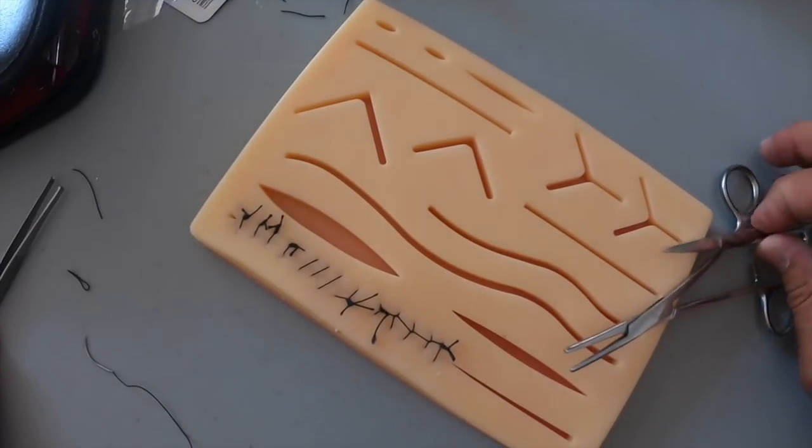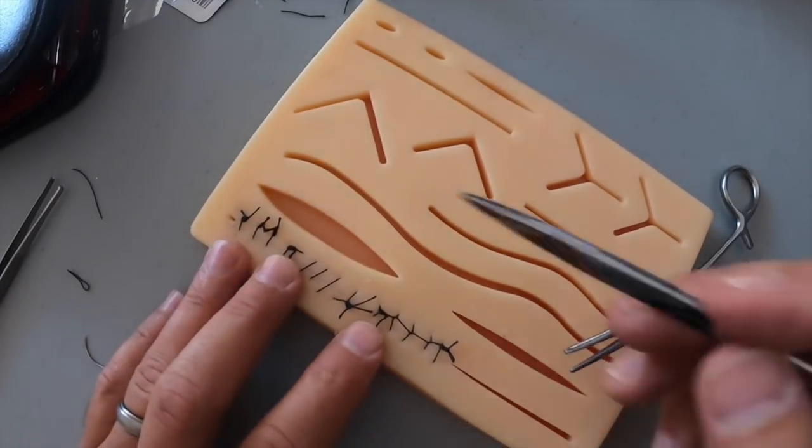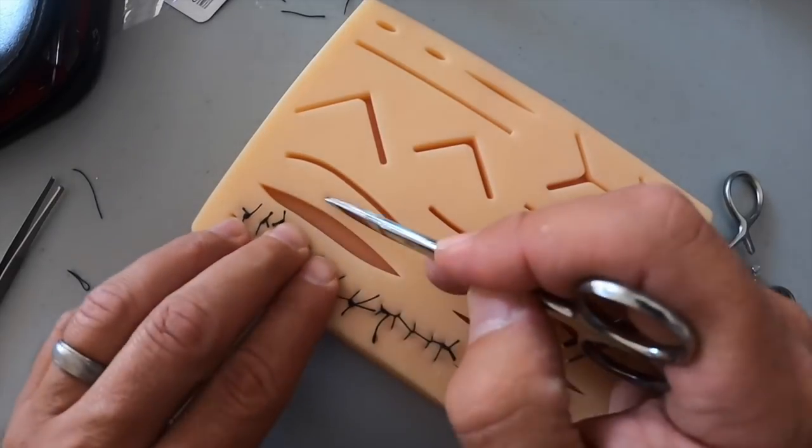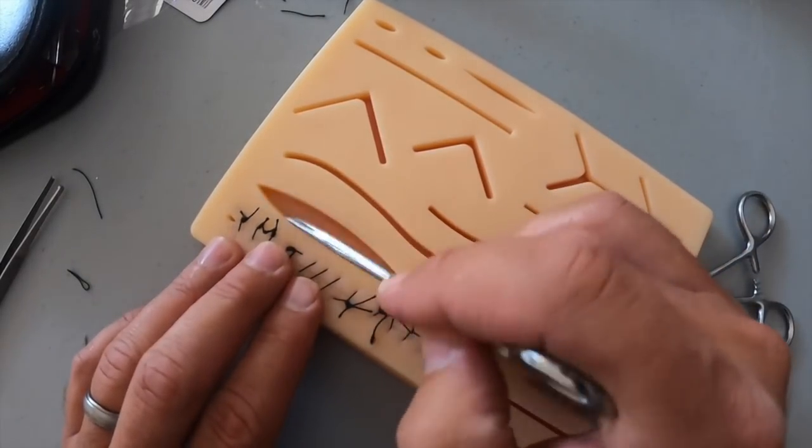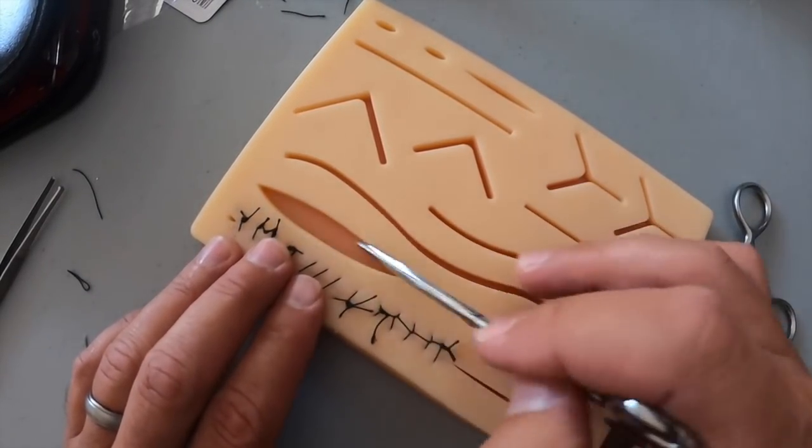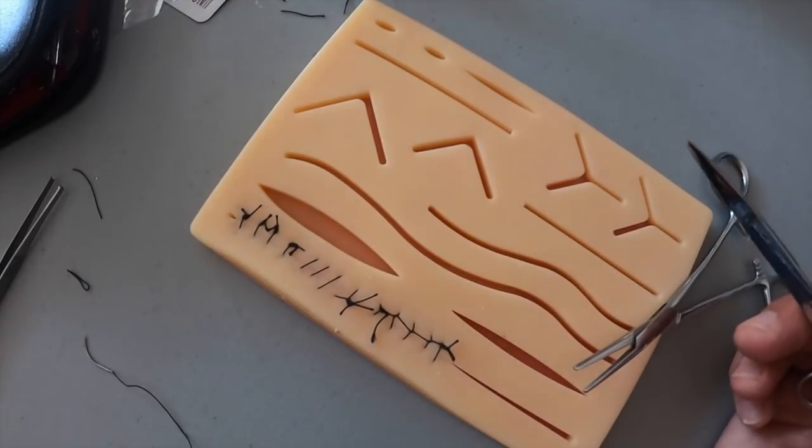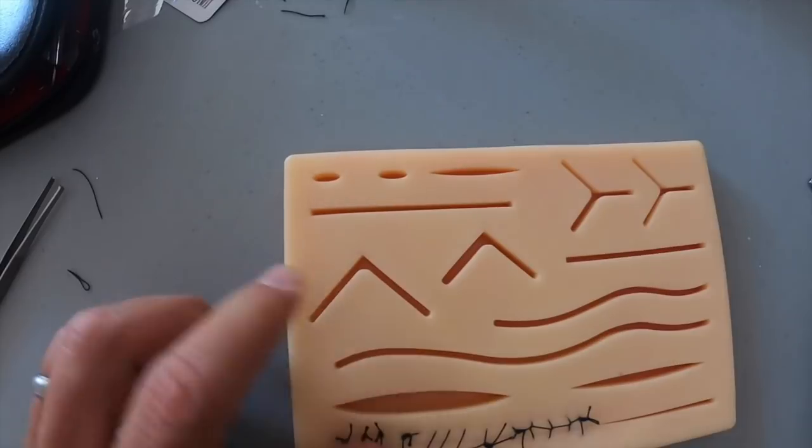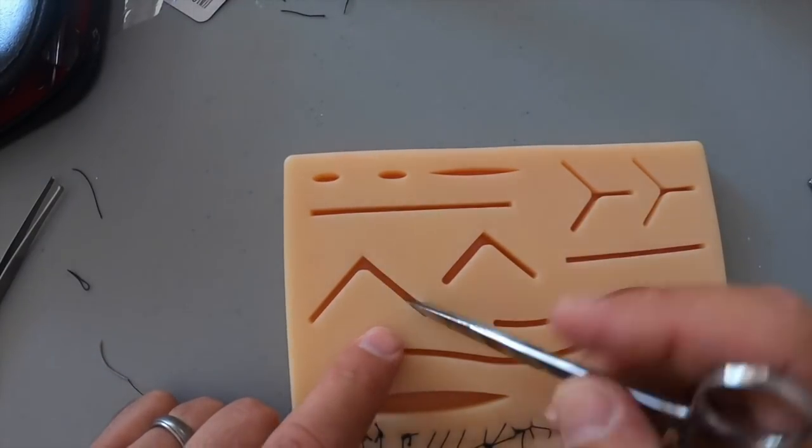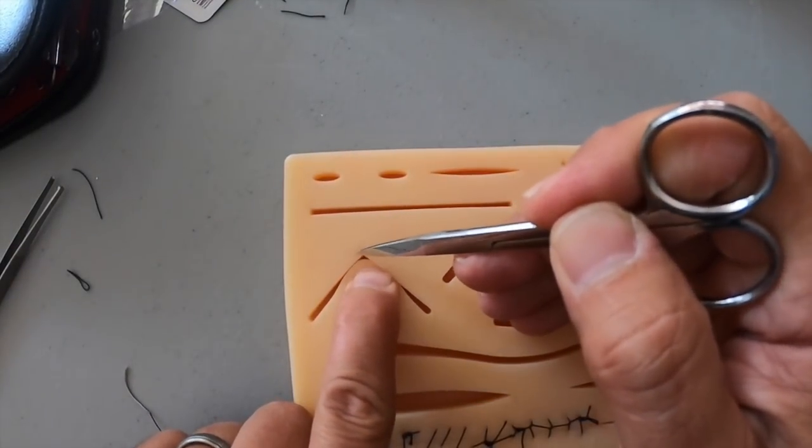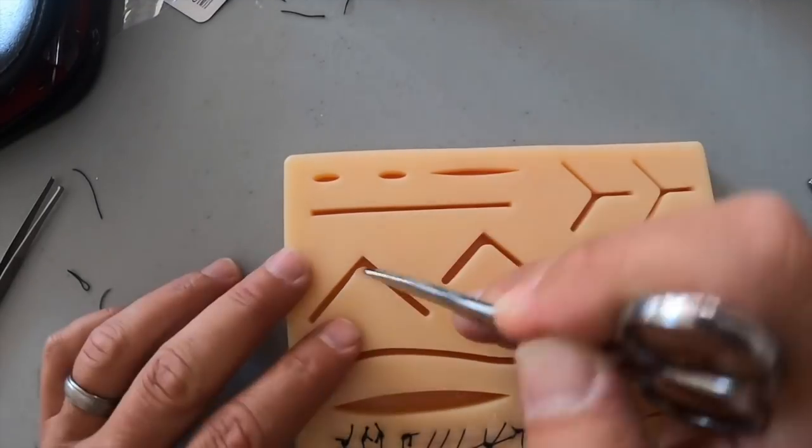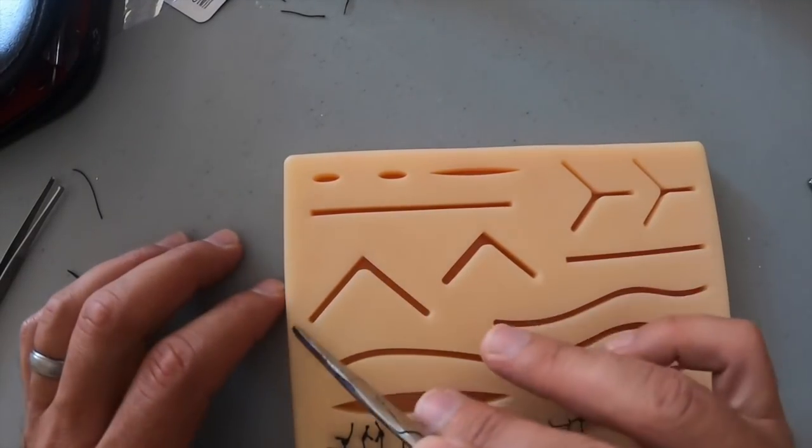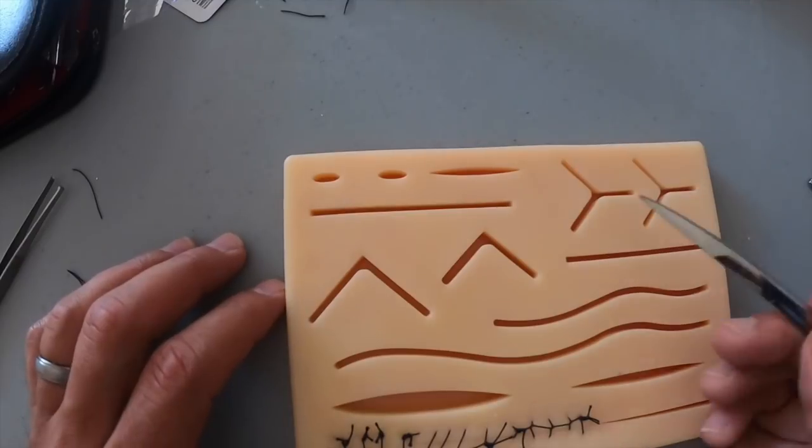All right, so that's the continuous interlocking stitch. To be honest, this is probably eighty percent of my lacerations now. When they're complex and there may be deep, then I'll do my deep stitches and bring it closer, and then I'll try to close it with either a continuous or a continuous interlocking stitch. Or if it's a complex one like this where you have a V, then I'll figure out, okay, I'm going to do this corner and tighten that out, and then I'll do a continuous here and a continuous here.